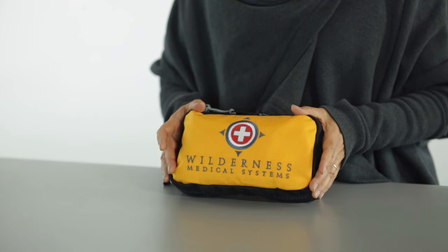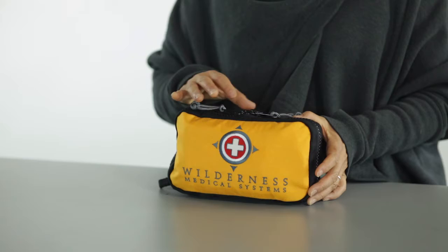Hi, I'm Donna Von Nita from Wilderness Medical Systems, here to introduce you to our Mayfly kit. The Mayfly was designed to be your everyday companion — light, easy to use, yet it has tremendous capability.